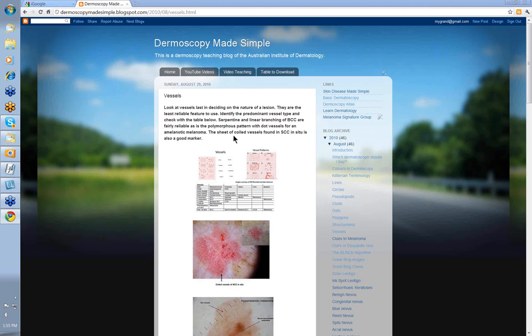If the tumor's thicker, the loops are a lot longer and they're spreading over the lesion. When you look at them obliquely, they look like looped vessels or what they used to call hairpin vessels. These looped vessels are best seen at the edge of the lesion. With keratinocytic tumors, these looped vessels also have a clear halo around them of keratin, due to the unsheathing keratinocytes. That feature isn't present in melanocytic lesions, so it's a good differential.